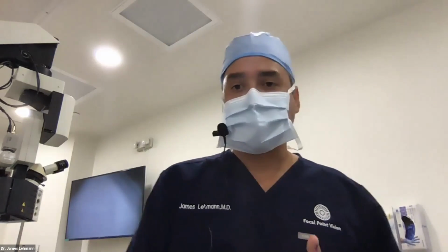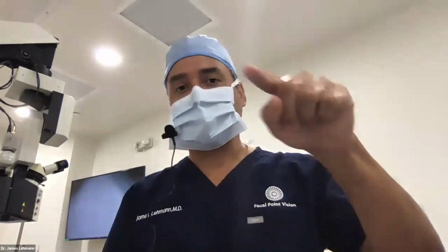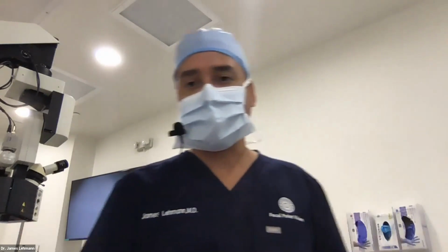And for DSEK and DMEK, we sit temporally. So again, it's what you're accustomed to. Dr. Agarwal asks, please guide about ideal side port wound construction. That's iris plane in and out, 1 to 1.5 millimeters.